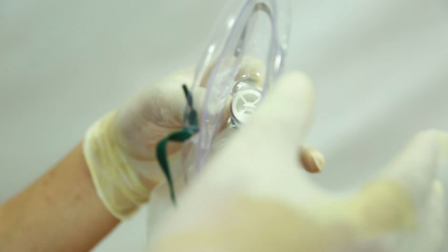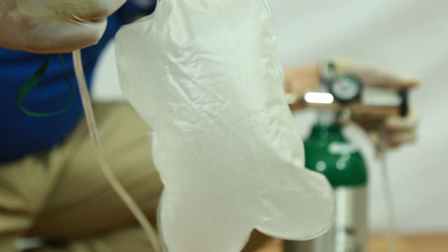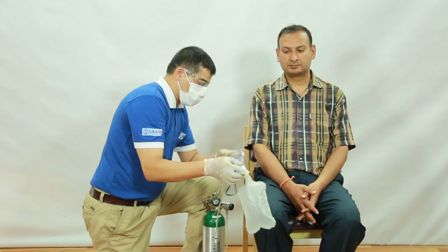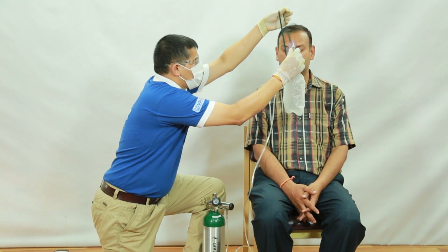Non-rebreather mask. Face mask with an oxygen reservoir bag and one-way valves. Requires a tight seal to ensure high oxygen concentration delivery, 10 to 15 liters per minute. Oxygen delivered, approximately 80 to 95% oxygen concentration.